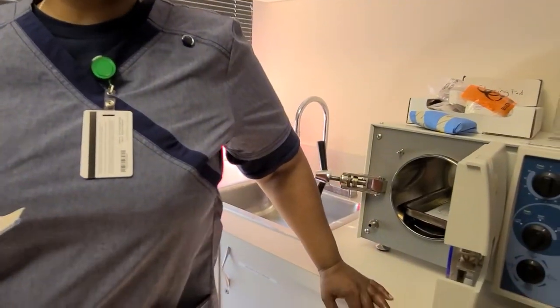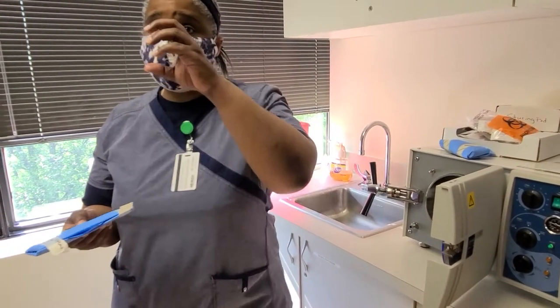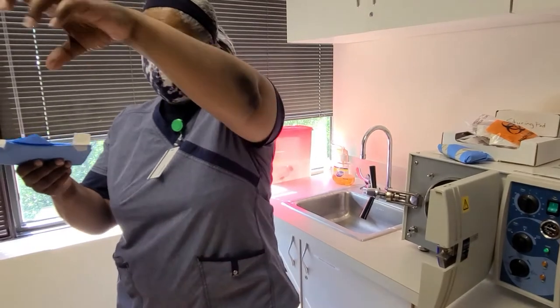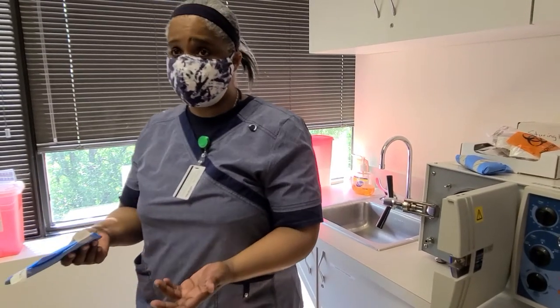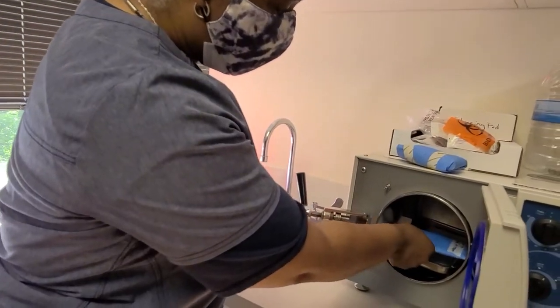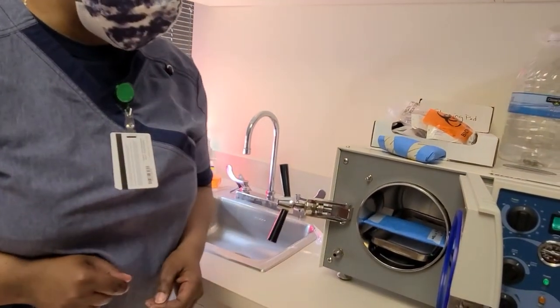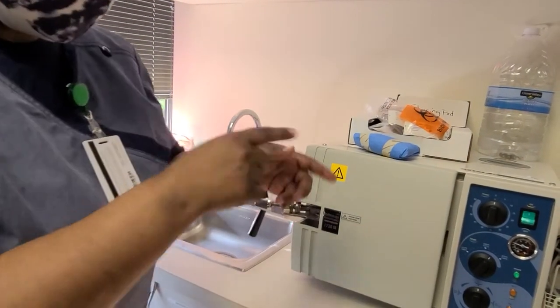Say you're doing a post-op surgical dressing. I can put a little round cling wrap, like you saw, and I can also put some 3x3 or 4x4 gauze in there. They'll use that during the surgical procedure, but you'll also use it when I'm doing a post-op dressing change. So I'm going to place this in here, kind of to the side, like that. After that, I'm going to close this and lock it.